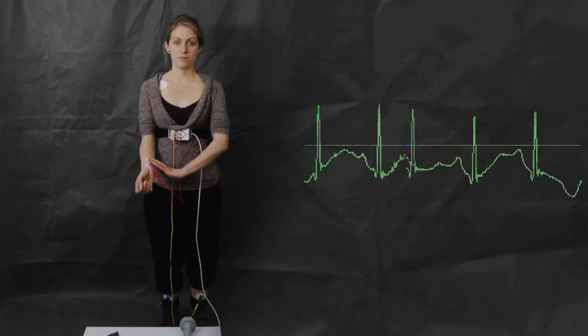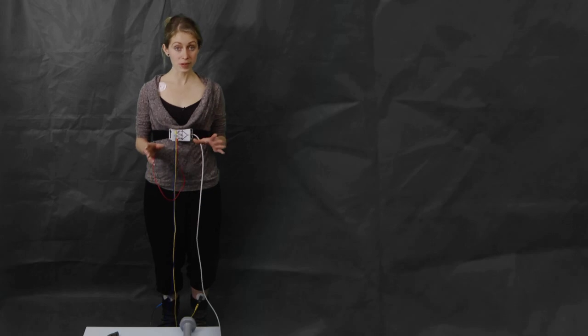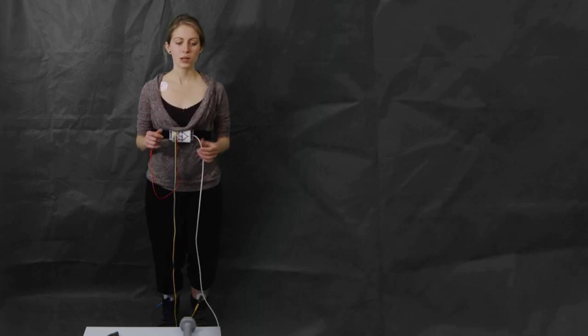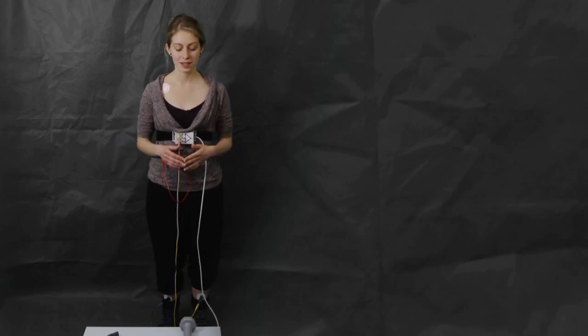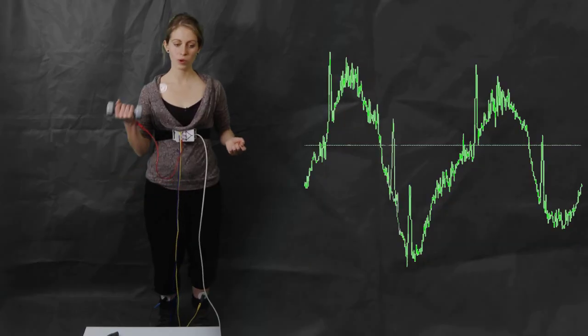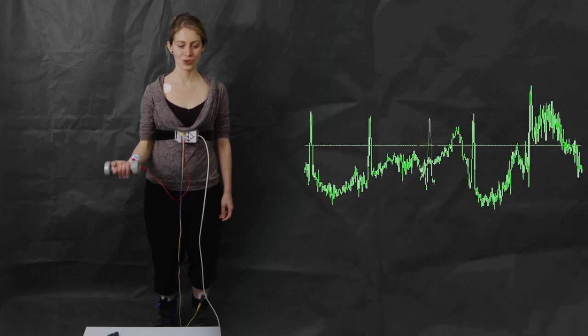So, apart from really old and dried out electrodes, something else that could get in the way and create a lot of noise in our ECG recording would be artifacts coming from our muscular activity. So let's look at the example of me exercising on a treadmill. And in order to demonstrate this, I have brought along a dumbbell, which is this weight here. And I will just use this arm to lift the weight just a few times and see what we get on the screen by doing this movement.